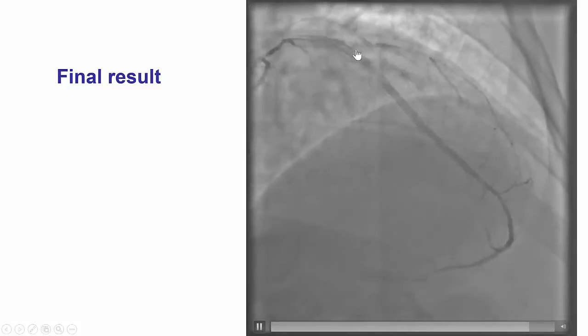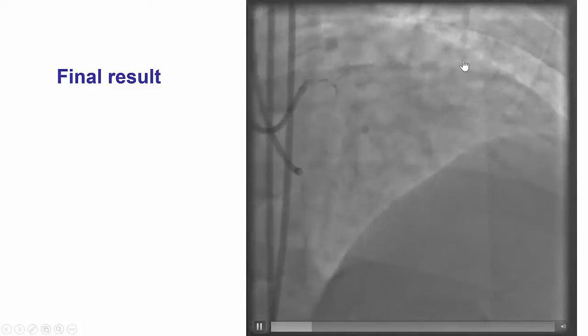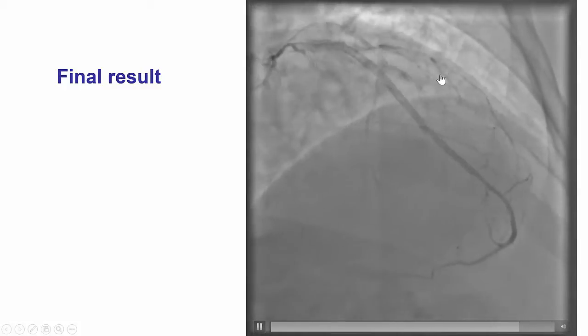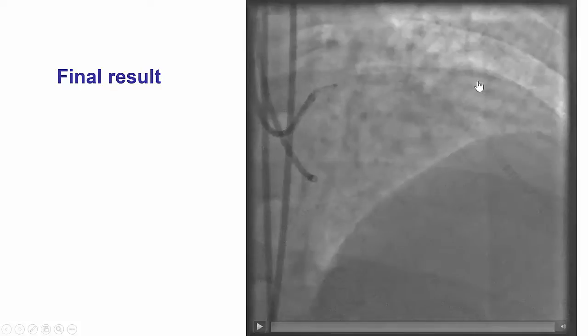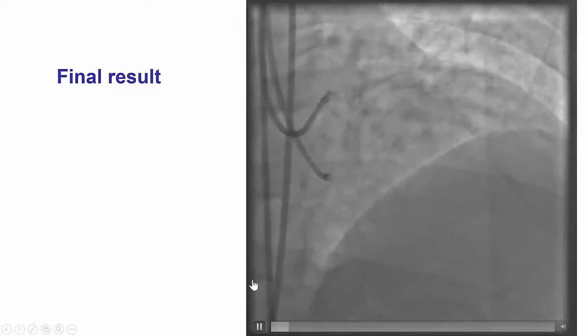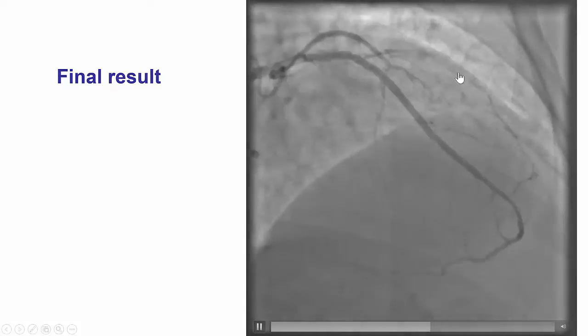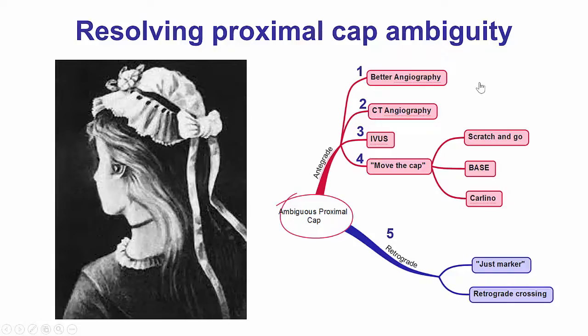Unfortunately, we were unable to preserve TIMI 3 flow in the diagonal branch. However, there was some flow into the branch, and it will potentially improve over time.